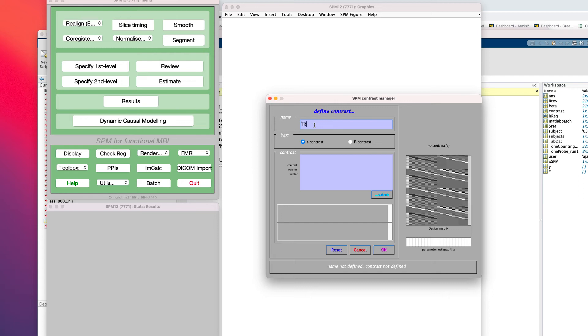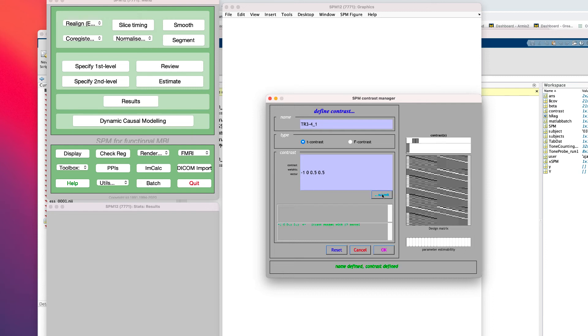Clicking on Results again, select the same SPM.mat file and define this contrast. Negative 1, 0, 0, 0.5, 0.5. Since we are comparing two regressors against one, we will need to control for this number by weighting them by 0.5 each. This will create a series of contrast weights that looks like this.